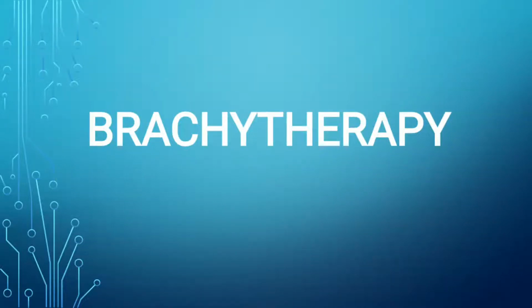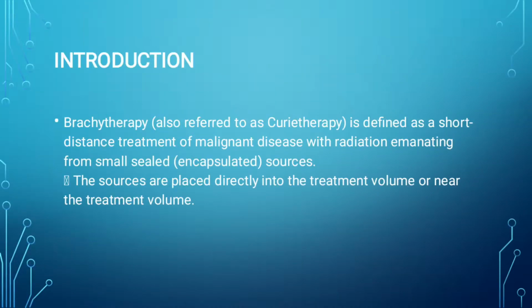Today we will discuss brachytherapy. Brachytherapy is also known as curie therapy and is defined as a short distance treatment of malignant disease with radiation emanating from small sealed or encapsulated sources. The sources are placed directly into the treatment volume or near the treatment volume.